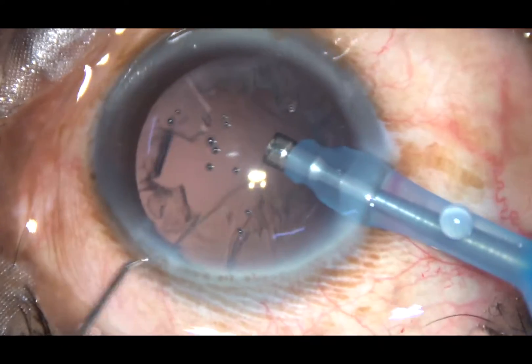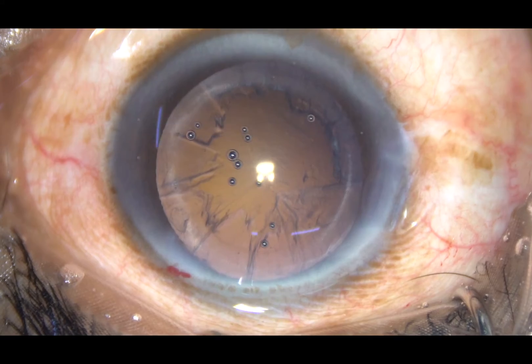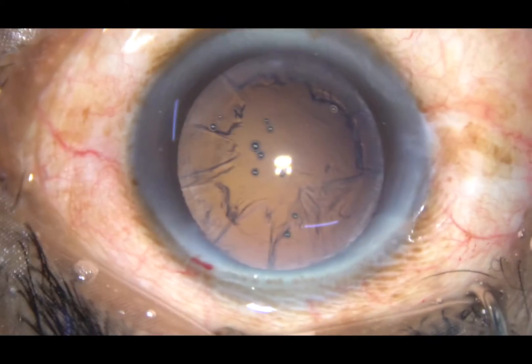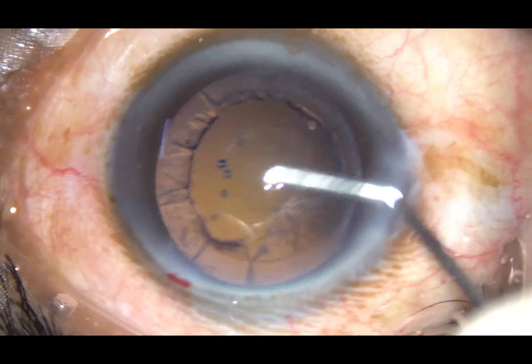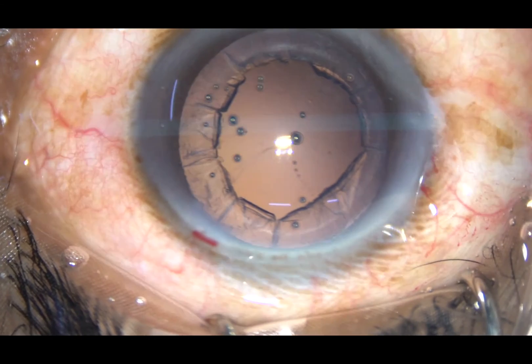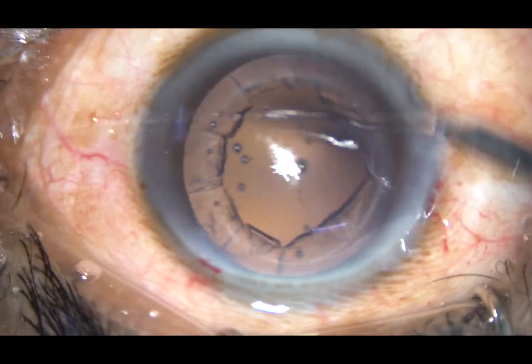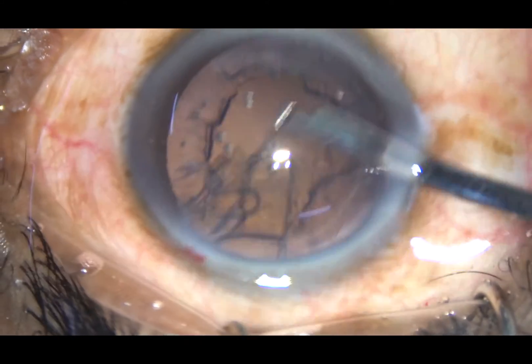The nucleus and epinucleus have been removed. Now some cortex remains. I inject some viscoelastic substance at this moment, then take a 23G Simcoe cannula to remove this cortex.